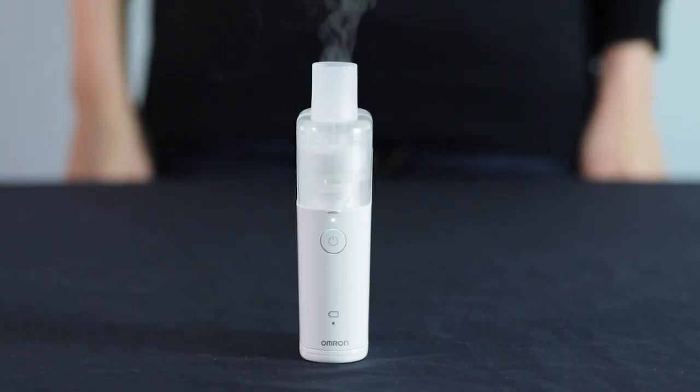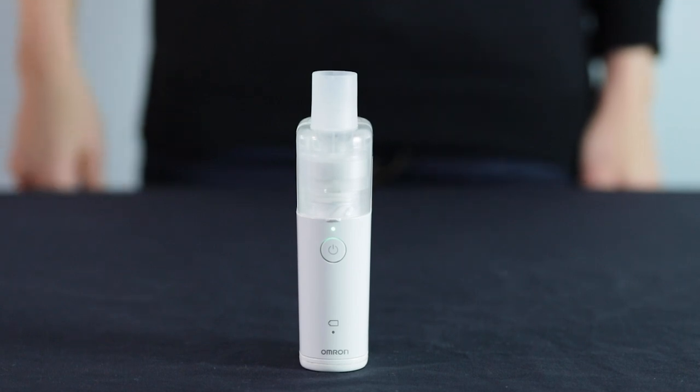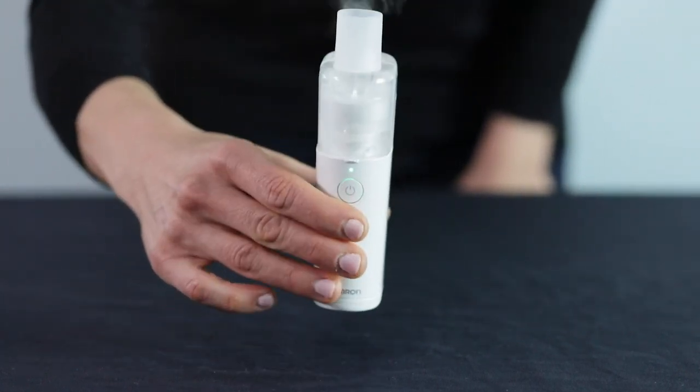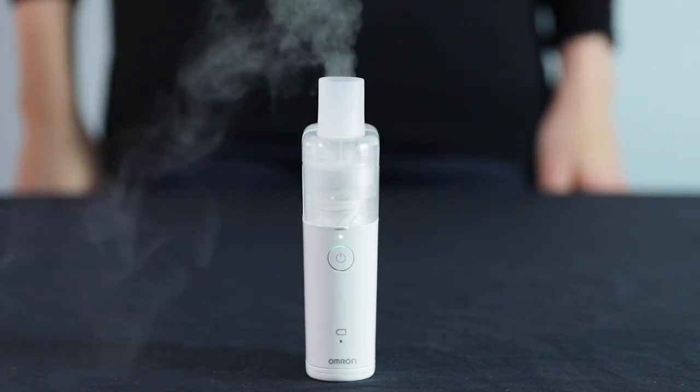This unit will sometimes stop dispensing medication while on. This is normal, and it is because the vibrating unit is not immersed in medication. You simply need to tilt the unit and the medication will once again begin dispersing.